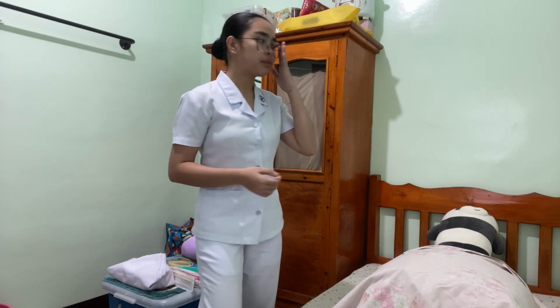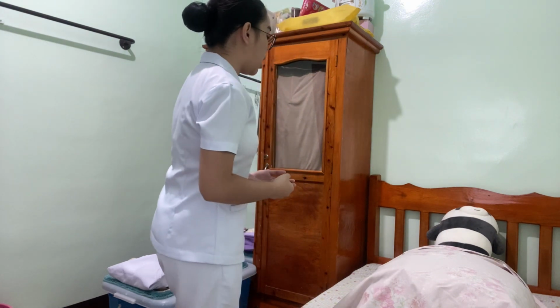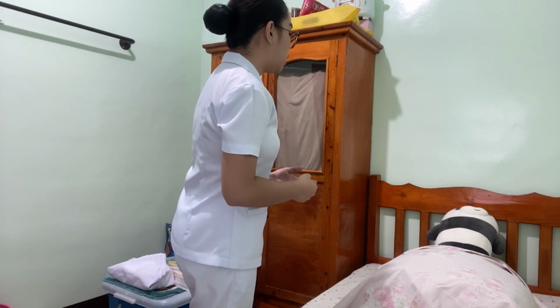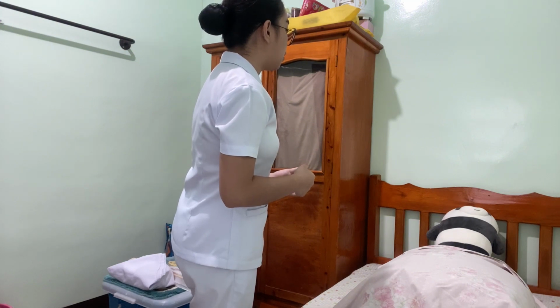Okay, so now we are going to explain the procedure to the patient so that the patient will be well aware of the whole procedure and also for them to cooperate well. Okay, ma'am, so we understand that you are having a difficulty urinating, so your doctor, Dr. Grace, has ordered you to have a urinary catheter. So what I am going to do is to insert a tube through your urethra and connect it to your bladder so that you can excrete your urine.